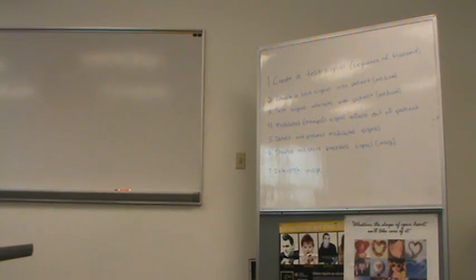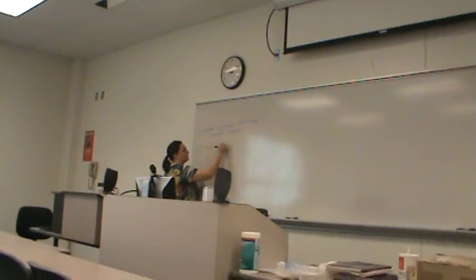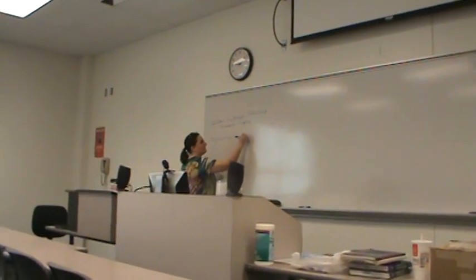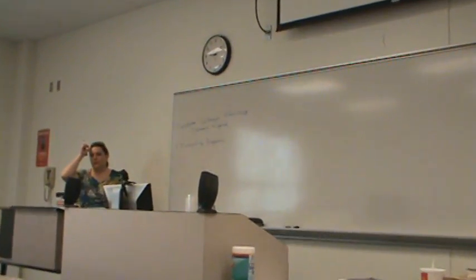So there's a whole bunch of system settings that we have that are going to affect our transmit signal. So the first thing is, what frequency are we operating at? So operating frequency is sometimes called transmit frequency.